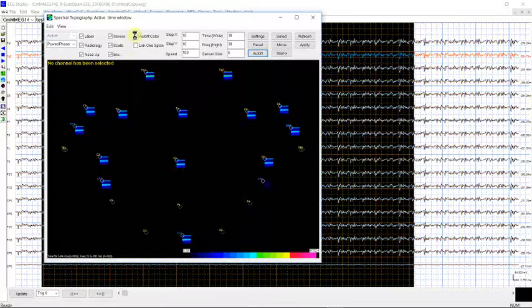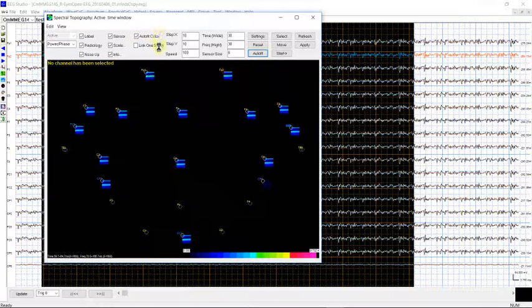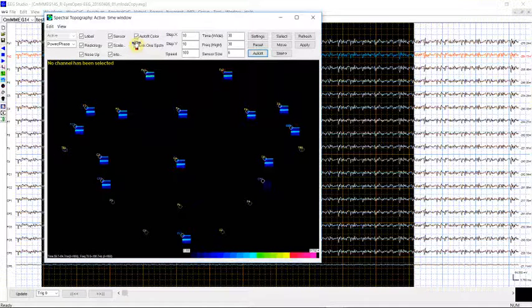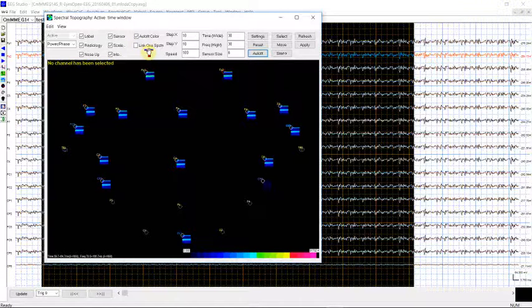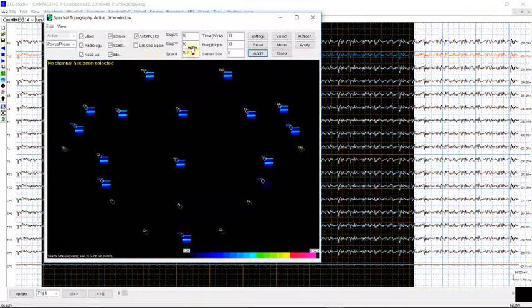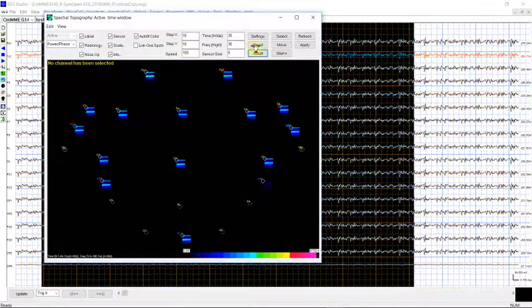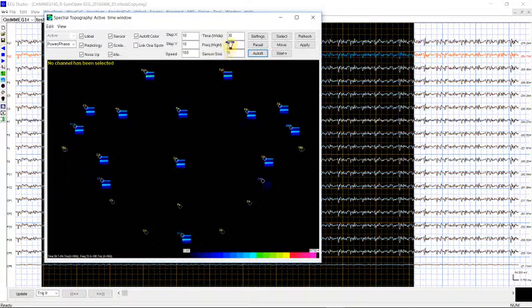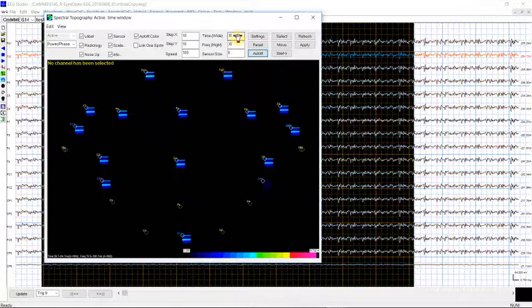The spectrum can auto-fit the color and automatically adjust the scale. We can link this window to a single channel spectral power. This step X and Y, that's for animations if you want to show the movie of this. And this is how wide the time frequency representation is here.